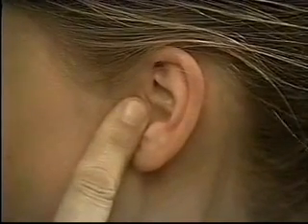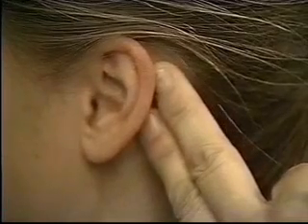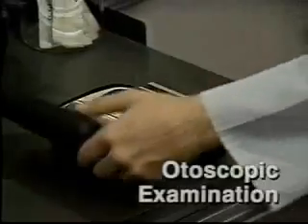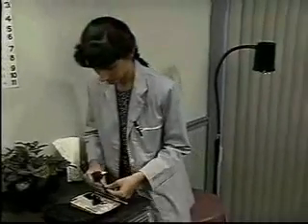Pain on these maneuvers suggests inflammation of the ear canal. Also, press firmly on the mastoid bone behind the ear. Tenderness here suggests middle ear infection. Next, examine the ear canal and eardrum using an otoscope.